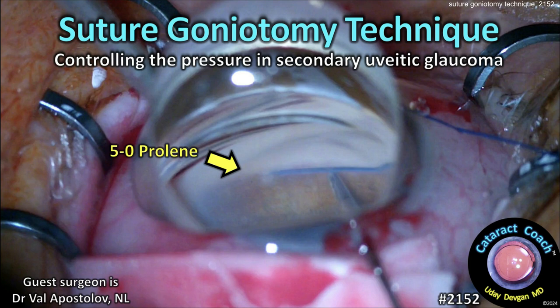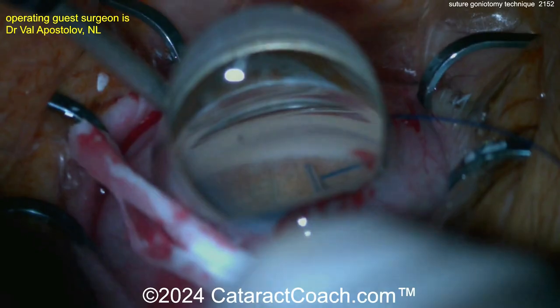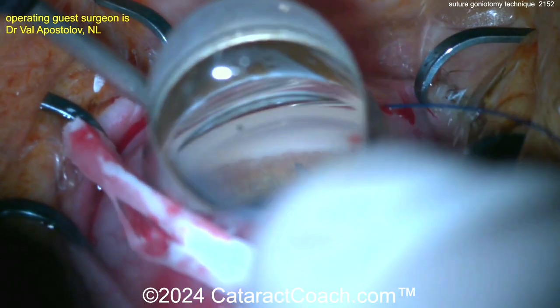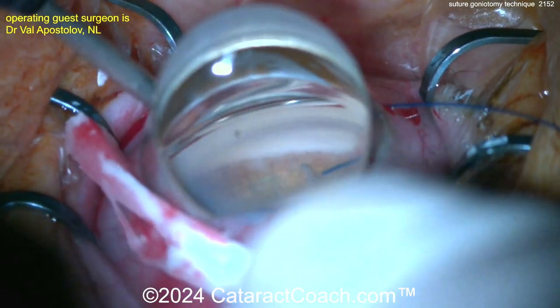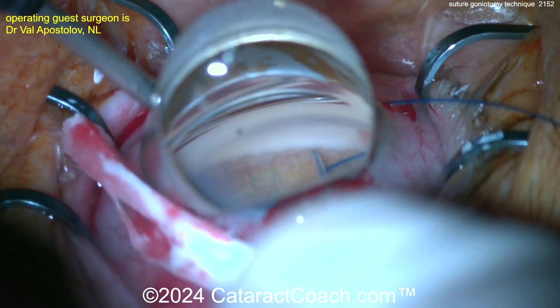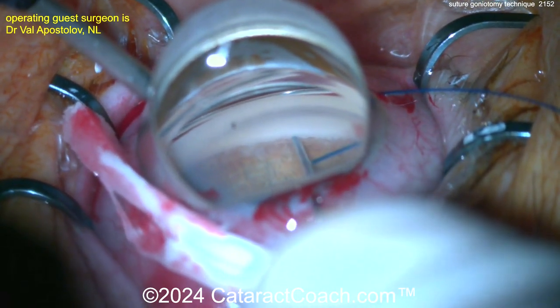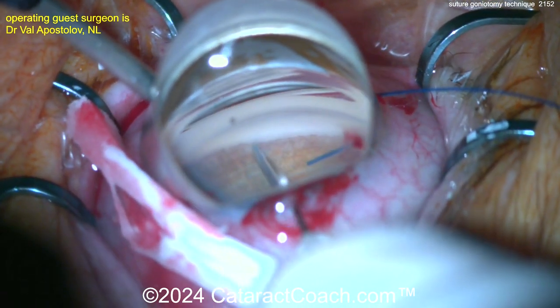CataractCoach.com suture goniotomy technique for controlling pressure in secondary uveitic glaucoma. Here's a nice gonioscopic view of the angle of the eye. The anterior chamber is full of viscoelastic. There is the suture — a 5-0 prolene suture — now making a little entry incision or opening here onto the trabecular meshwork.